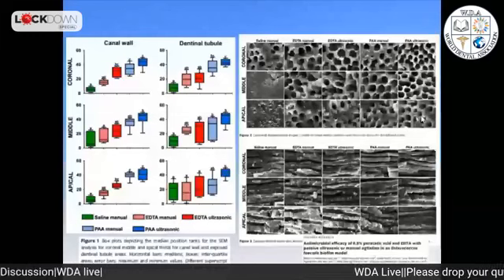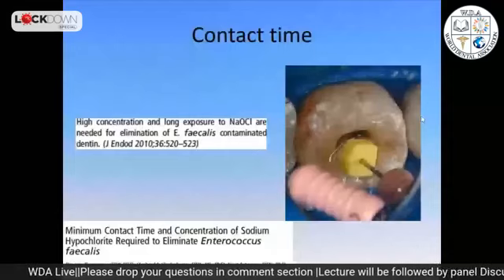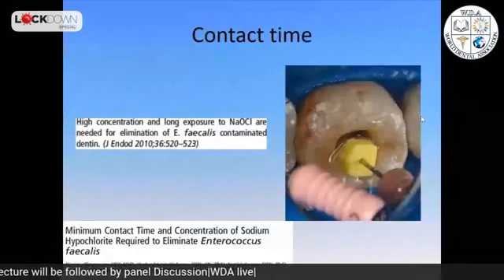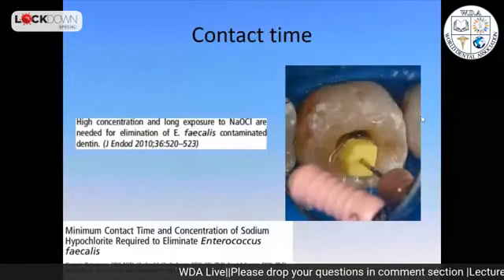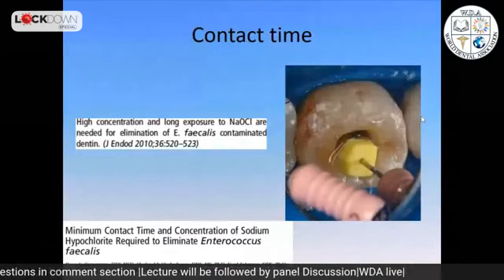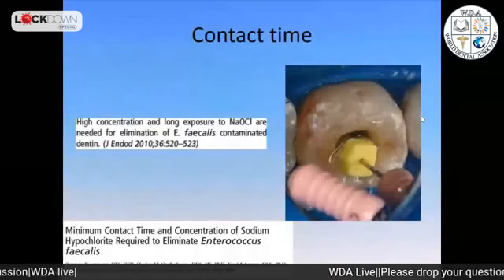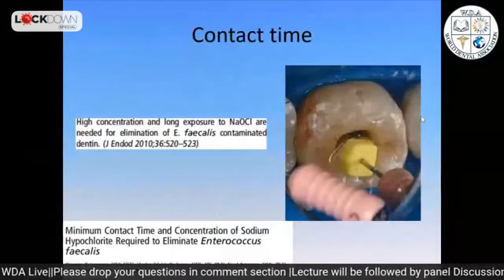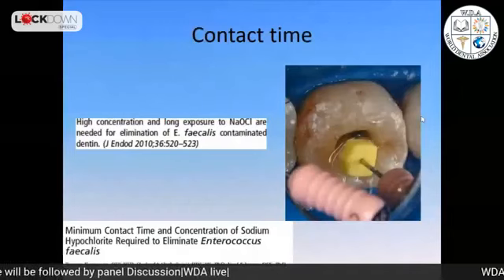Contact time. This is a clinical image. I always like to have a pulp chamber full of liquid. We often tend to do this problem where we are first preparing and then irrigating. Please keep your chemicals inside your tooth as long as you can. This will increase your action, your contact time, your disinfectant, and your tissue dissolution will work a lot longer. I always tell my students, I would like to see the pulp chamber full of liquid like a swimming pool, but totally dry on the outside. So tooth wet inside and dry outside.